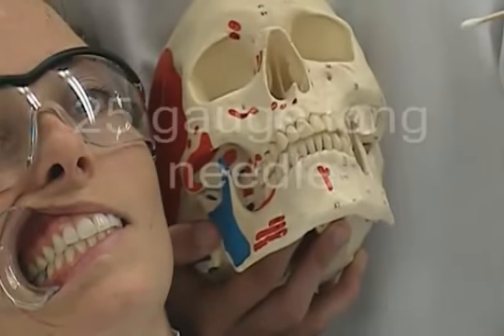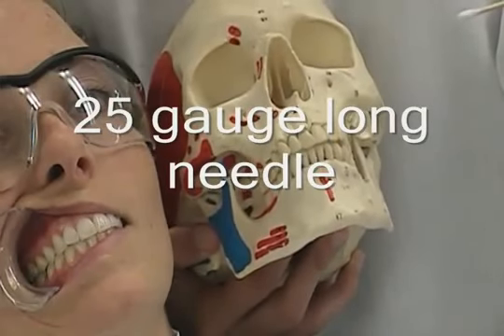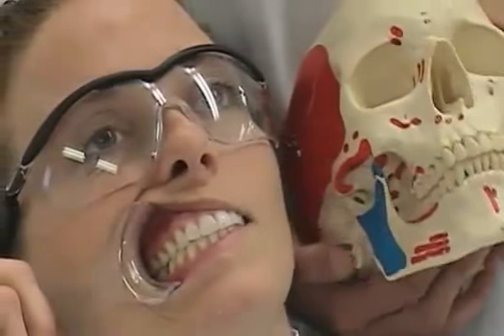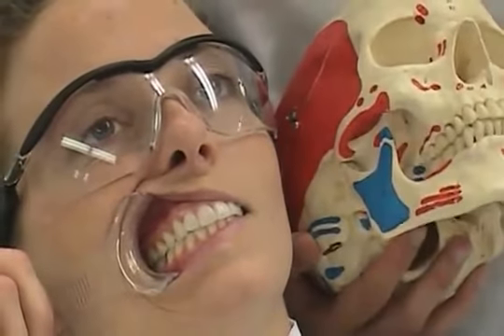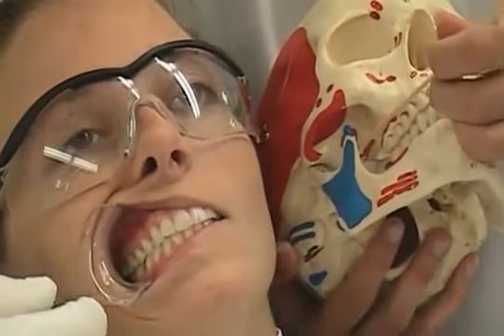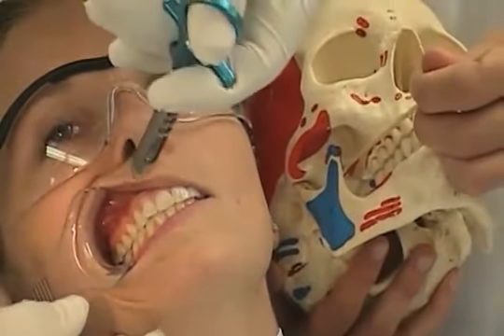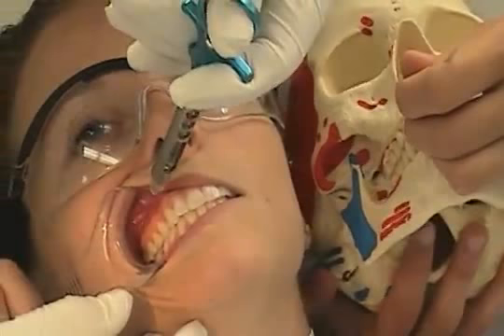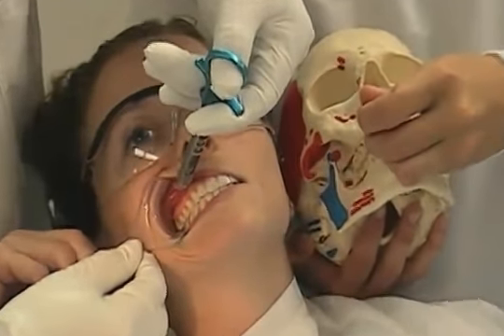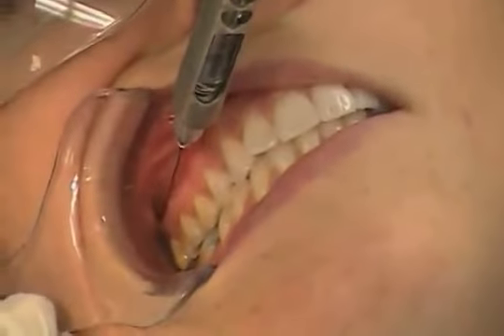Our technique: we'll be using a 25 gauge long needle. The area of insertion is the soft tissue overlying the medial lingual border of the mandibular ramus, directly adjacent to the maxillary tuberosity at the height of the mucogingival junction adjacent to the maxillary third molar.